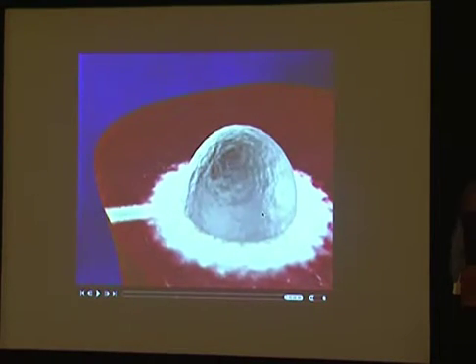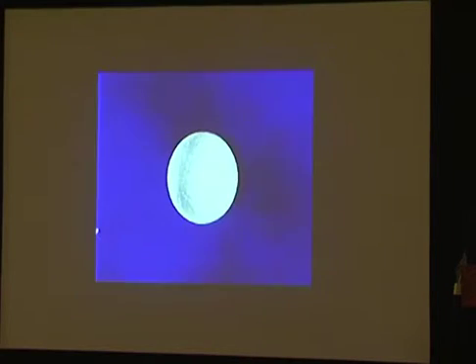almost 1 centimeter around the tumor. So if you have a 3 centimeter size tumor, we tend to create a lesion of diameter of approximately 5 centimeter. At the end, we tend to come out with a track ablation. We ablate the track through which we had gone.